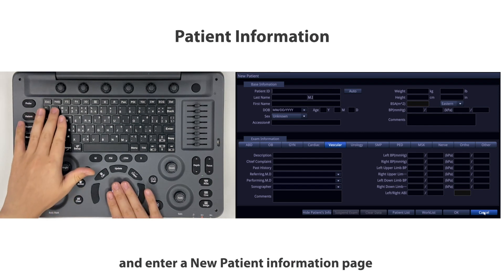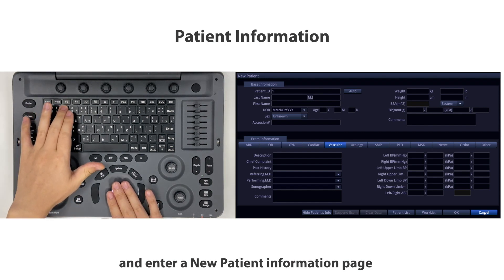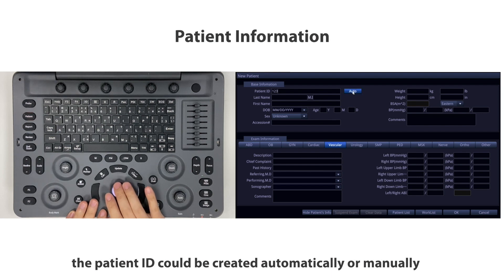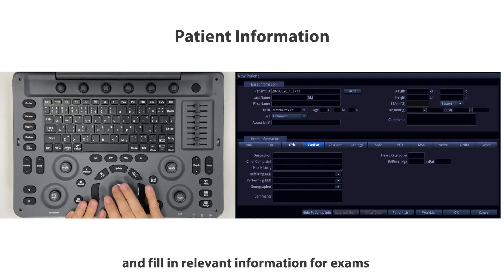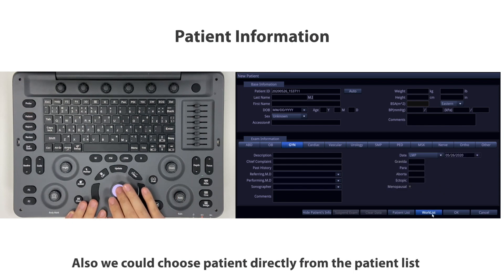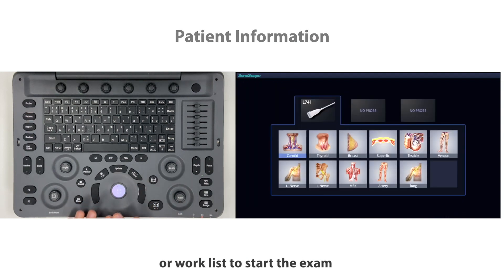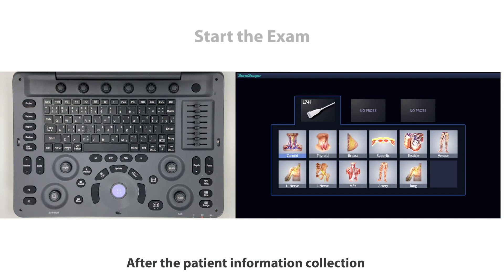Operation demonstration: Press the patient button and enter the new patient information page. Input the basic patient information — the patient ID could be created automatically or manually. Then choose the application and fill in relevant information for the exam. You could also choose a patient directly from the patient list or worklist to start the exam.